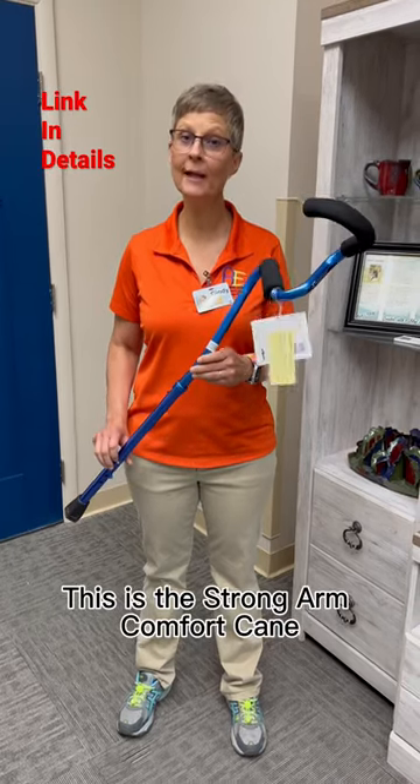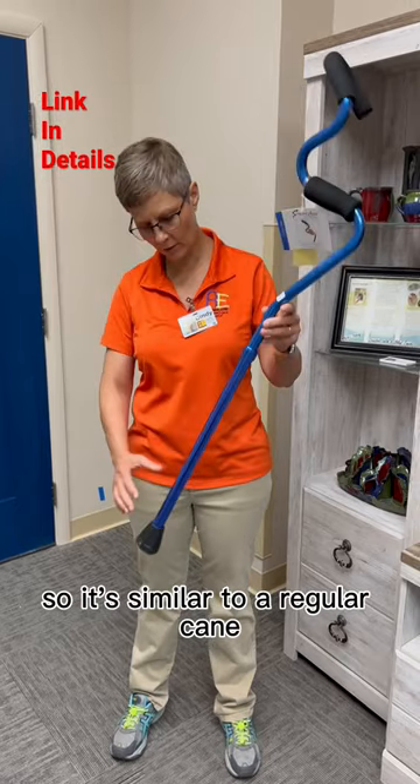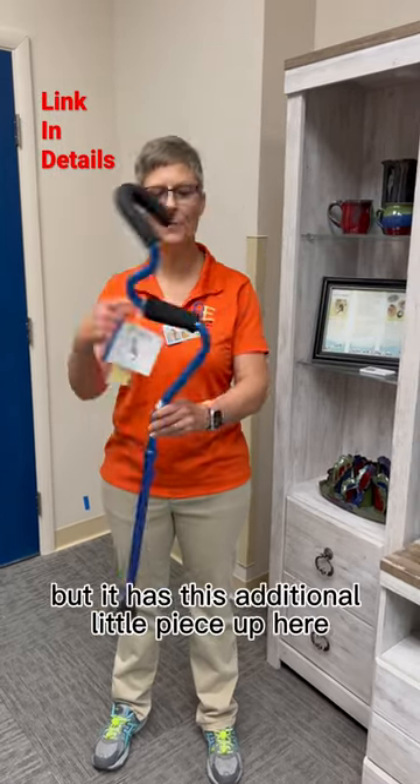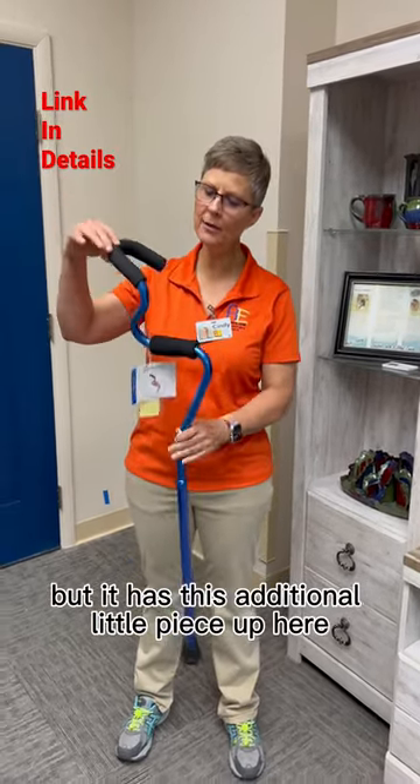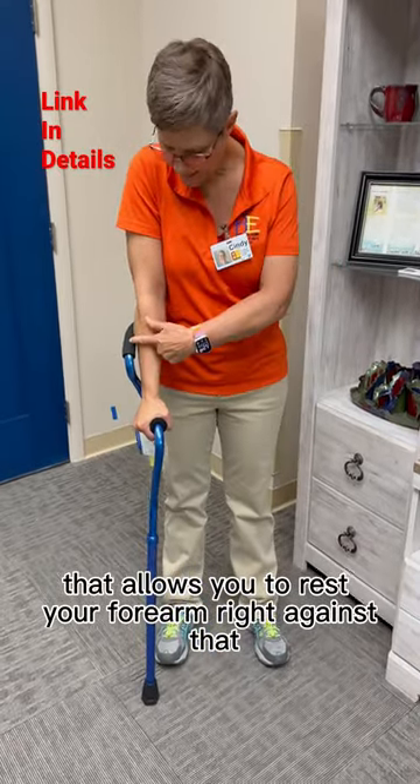This is the Strong Arm Comfort Cane. I've been wanting to get my hands on this. So it's similar to a regular cane — it adjusts like that — but it has this additional little piece up here that allows you to rest your forearm right against that.